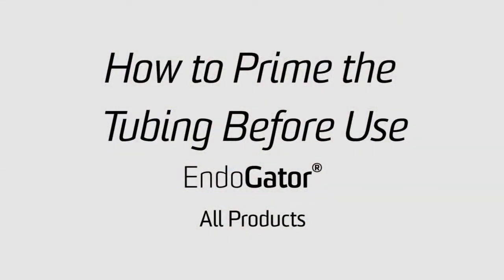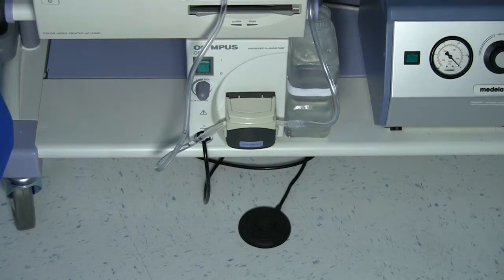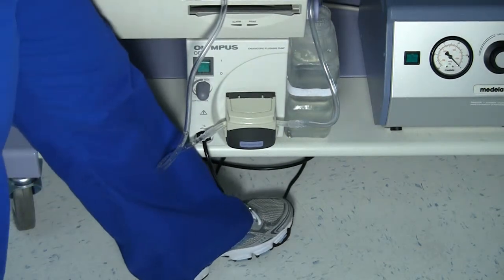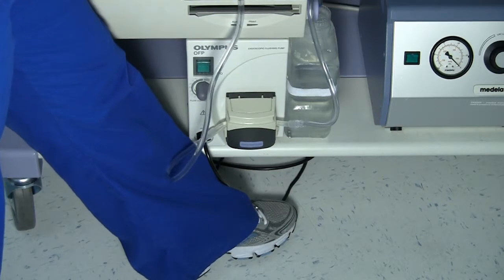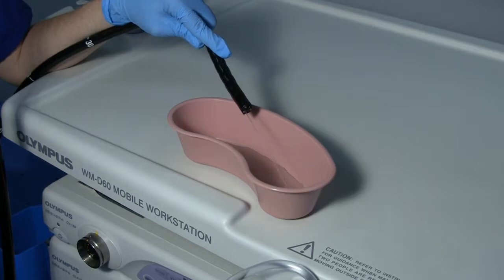Making sure you prime the tube set and scope for each case is extremely important. Doing this fills the channel with sterile water, creating a filled auxiliary channel, which impedes any backflow of tissue or debris from the patient back into the scope. It also allows you to verify the scope doesn't have any clogs, and a nice irrigation stream will be produced when the doctor calls for it. After the tube set is attached, simply place your foot on the foot pedal of the pump, engaging the pump system. Place the distal tip in a fluid receptacle and watch for a precise stream after a few seconds. Once you see the stream of water, the system is fully primed and ready for the procedure.